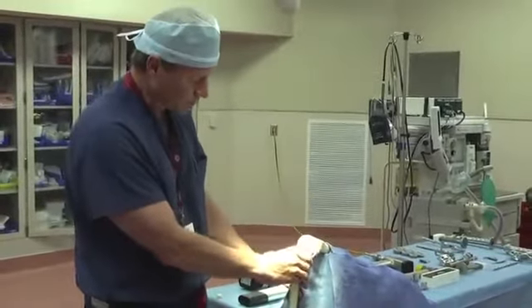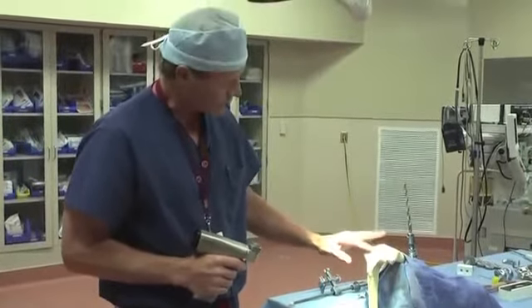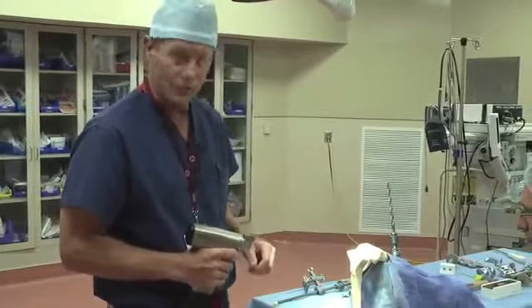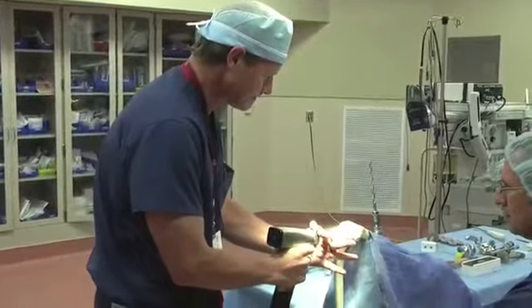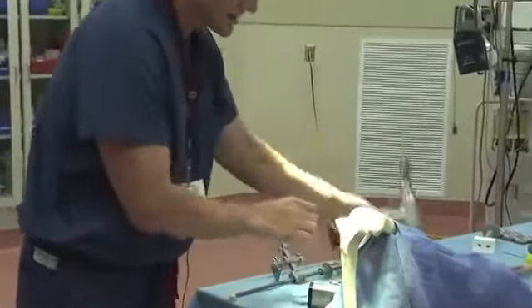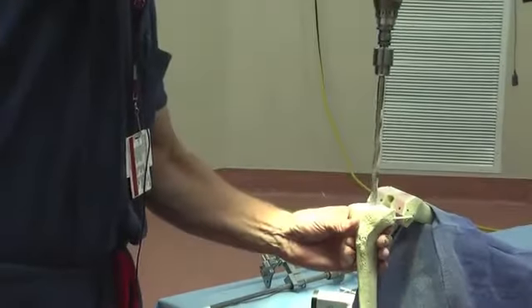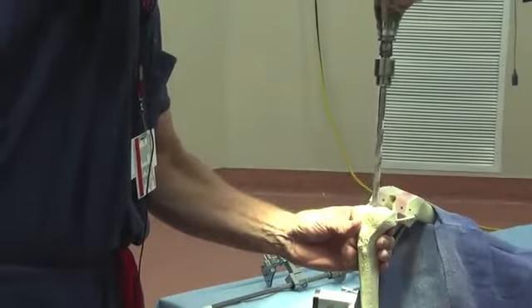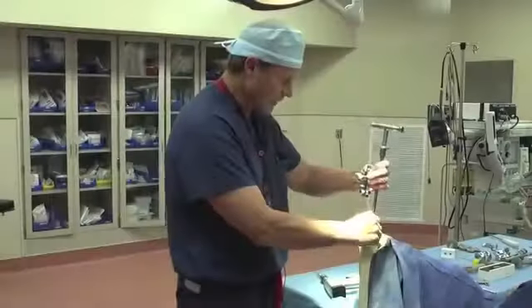We'll then bring the tibia forward and start to prepare that. This is just a personal preference of mine — I like to take off the tibial spines to make it flat, where I can drill the next drill in. Now we're working on the tibial side. Once I have a good flat surface to work with, we'll come in and actually put our drill in again for a rod. We'll use an intramedullary rod. You can do this with an extramedullary rod, but I like using the rods that go down the bone — I think we get a little bit better read on the alignment. So next, the rod will be placed down the tibia.